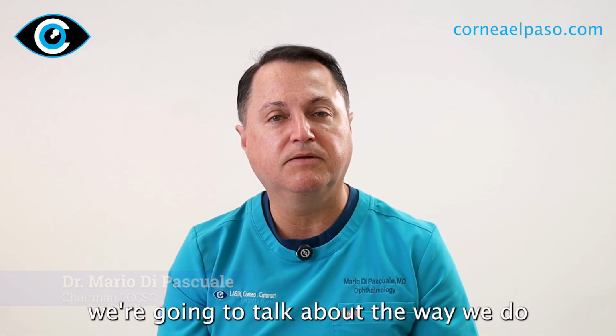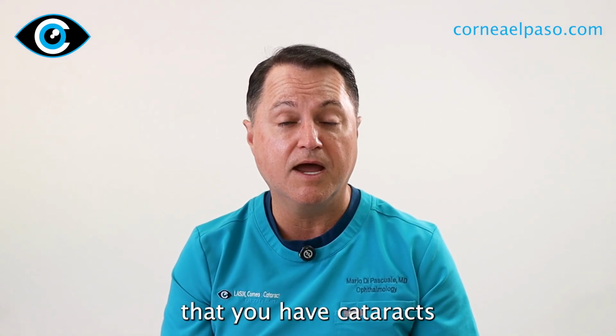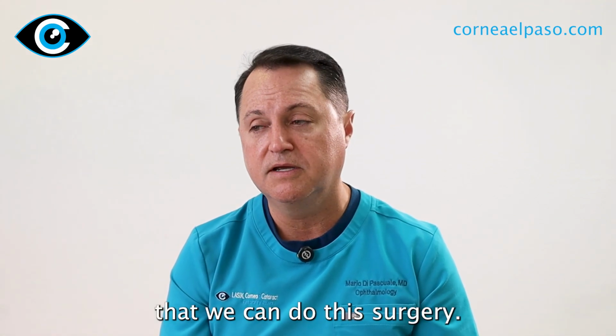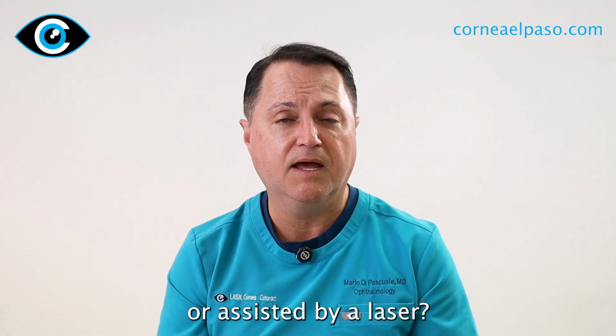Today we're going to talk about the way we do cataract surgery. Now your surgeon told you that you have cataracts and you're ready for surgery. Well, there are different ways that we can do the surgery. We can do it manually, 100% done by your surgeon, or assisted by a laser.